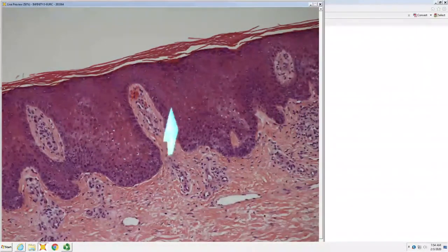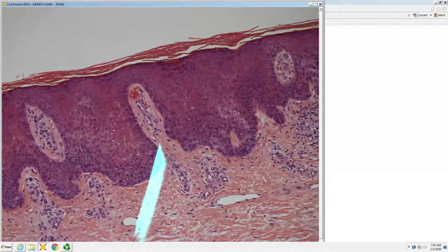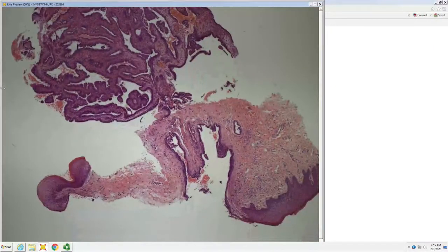Hyperkeratosis, hypergranulosis, angiofibroplasia of the papillary dermis. You normally should not see any bundled or ropey collagen above the postcapillary venule. Vertical streaking of collagen, like in lichen simplex chronicus. Like an S-PAP, because you can slide into it, as opposed to an H-PAP, which would all be down here, so you could hide in the H-PAP, slide in the S-PAP.